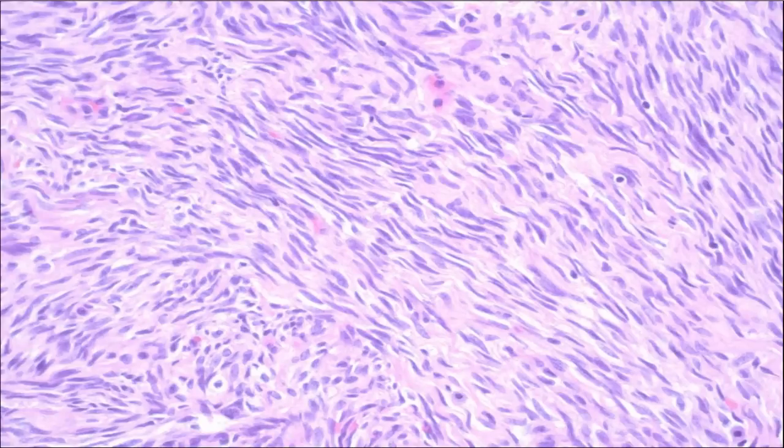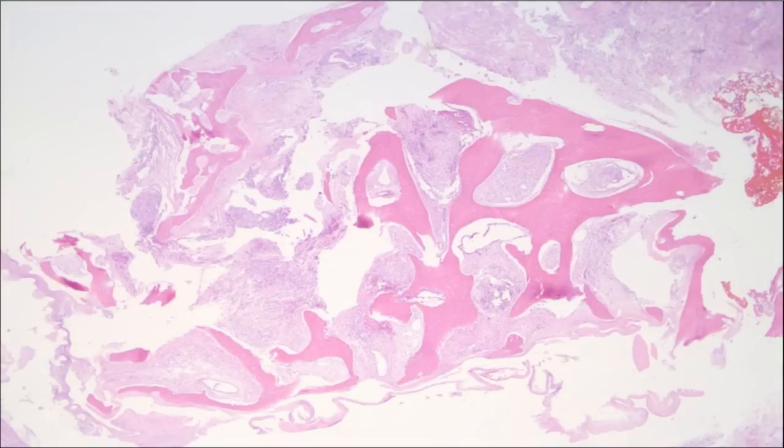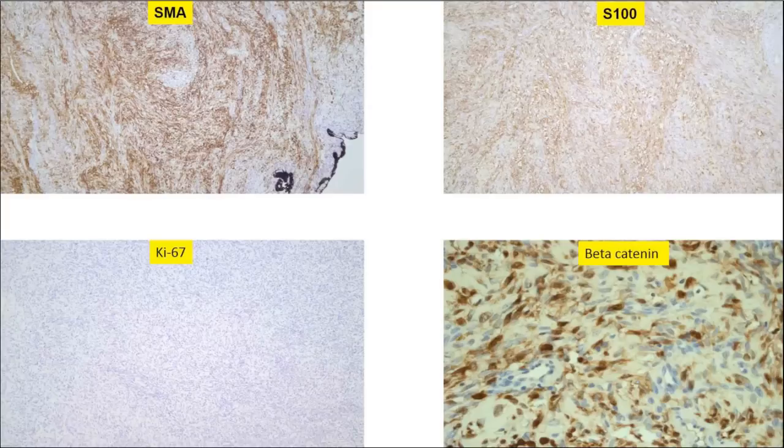And just a higher power here, showing how bland, very minimal mitotic activity, no necrosis, but it was invading into bone, as you can see here. So there was no problem saying that it was a malignancy. And in terms of immunohistochemistry, this was strongly positive for muscle markers, so smooth muscle actin as well as S100, very low proliferative activity with Ki67, and actually nuclear beta-catenin in a proportion of the cells.